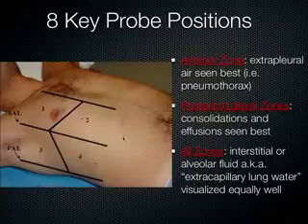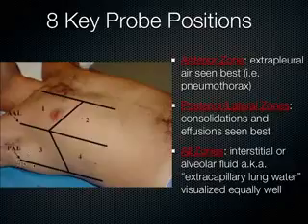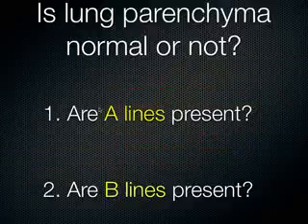This is where you stick the probe when you're doing one of these lung ultrasounds. You put it anteriorly here, a little more inferiorly over here, and then more laterally here. Okay, so this is the anterior axillary line, posterior axillary line. And this is kind of what divides these areas. And the sternum is right here, so this is just sort of right parasagittal to the sternum.